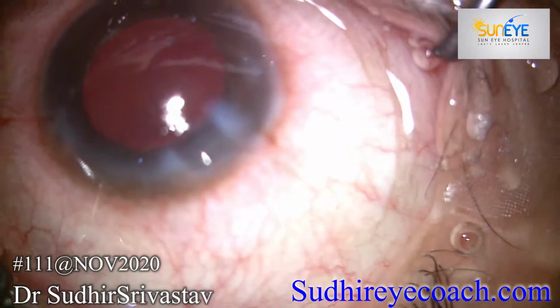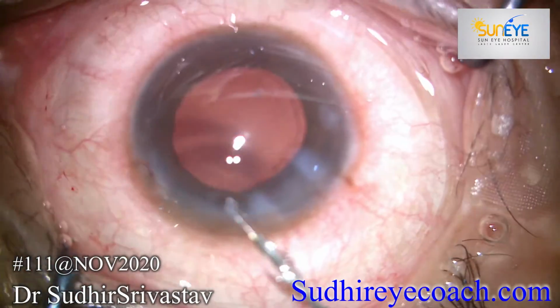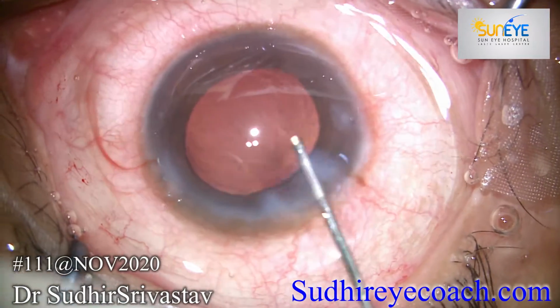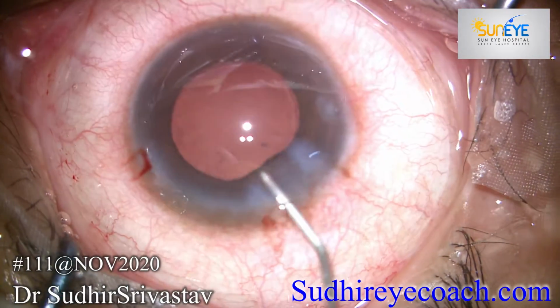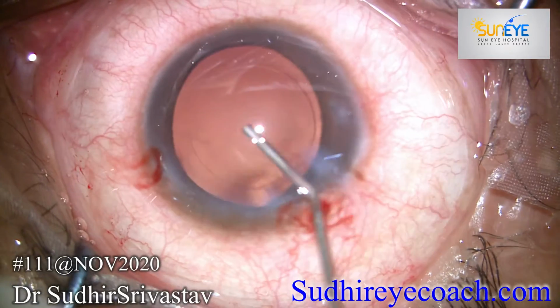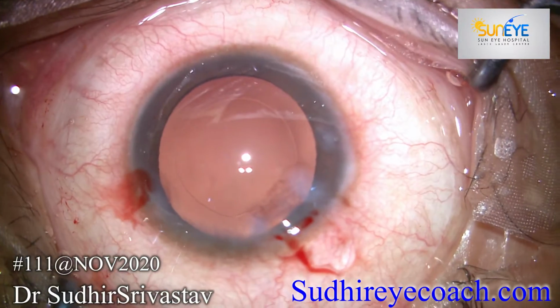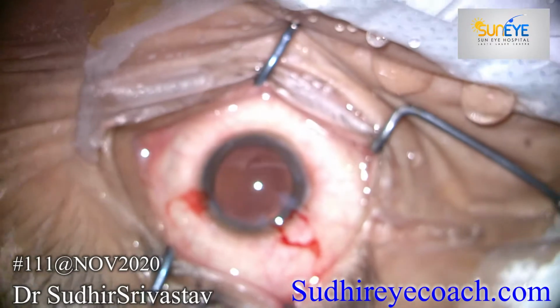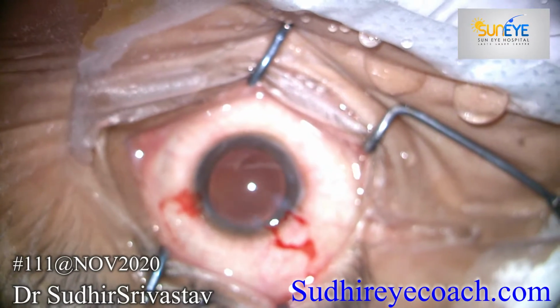After irrigation and aspiration, flush the BSS parallel to the posterior capsule. It removes the visible cells and fibers. Now fill the chamber with high viscosity viscoelastic. Now you can see a beautifully centered, adequate size capsulorhexis.